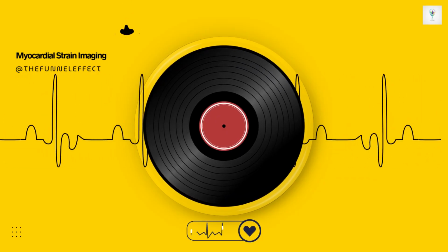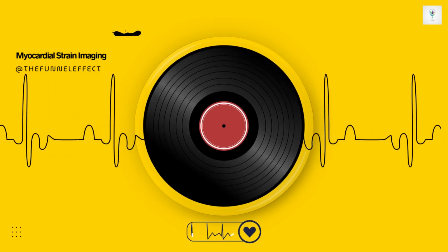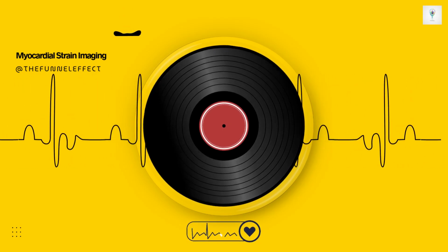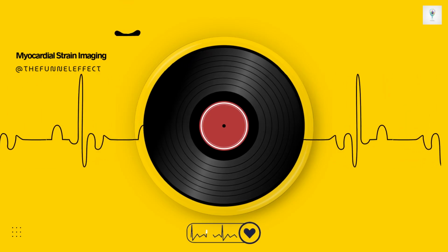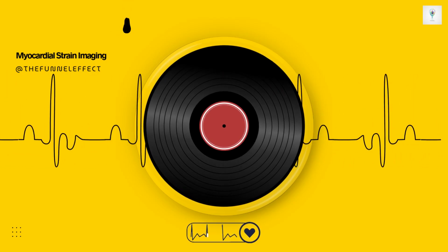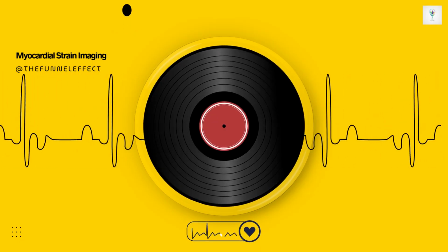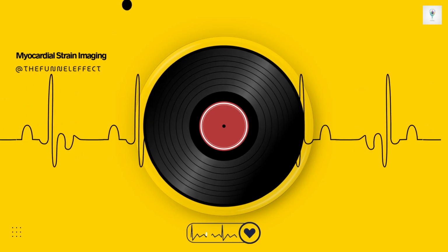So it basically replicated the idea of those invasive metal markers, but non-invasively using magnetism. Precisely. You could see the grid deform as the heart contracted, allowing for 3D strain measurement. For many years, tissue tagging was considered the clinical gold standard for validating all the newer strain methods, including the feature tracking techniques we'll talk about.